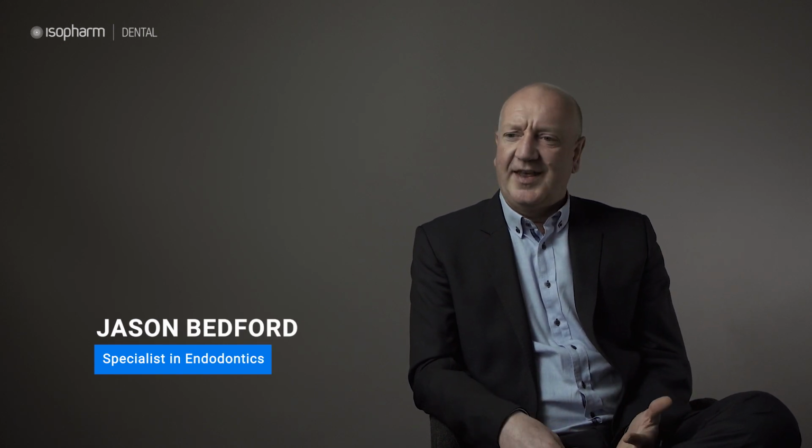So tip number one, getting the diagnosis right. Obviously nice for your patients if you get the diagnosis right first time. There's no substitute for a full clinical examination, taking into account the patient's medical history, their dental history, the signs and symptoms that they're presenting with. But still in these days of CBCTs and 3D imaging, we use our standard periapical films as a great way of establishing a diagnosis for patients.